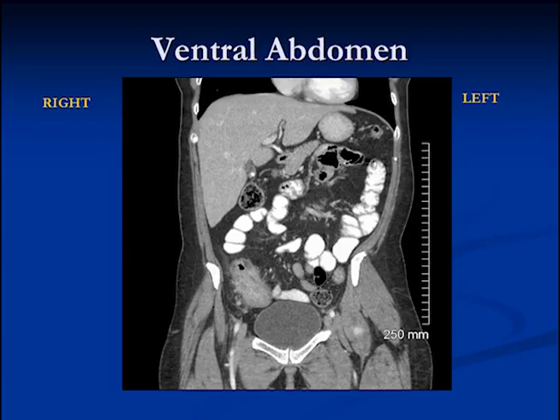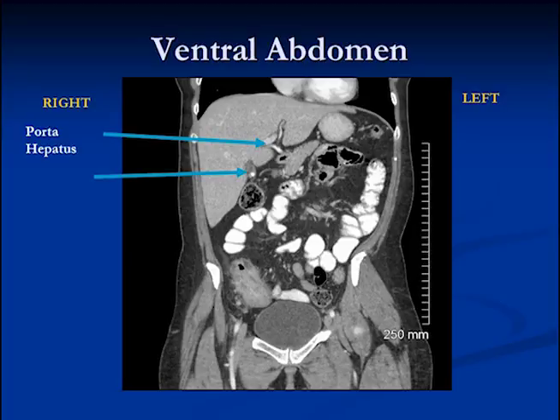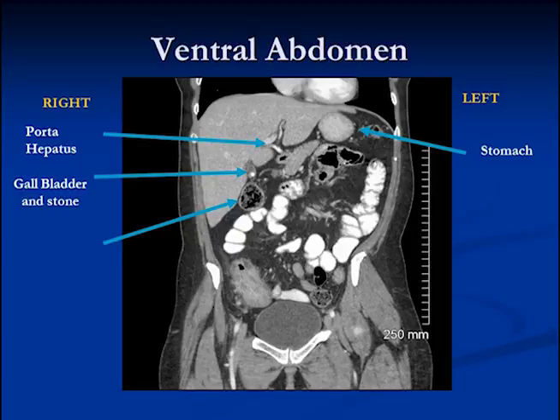Going a little further forward, this is the ventral abdomen, just more or less just below the skin. This is the porta hepatis, where all of the common bile duct, portal vein, and hepatic artery all go into the liver. This is the gallbladder again with the gallstone in the center of it. We can see the stomach here — we know it's the stomach because it's bright and there are concentric folds in it. This is large bowel containing fecal material. All the contrast here is in the small bowel — none is in the large bowel, and often you don't need contrast in the large bowel because you can identify it fairly easily with the feces.